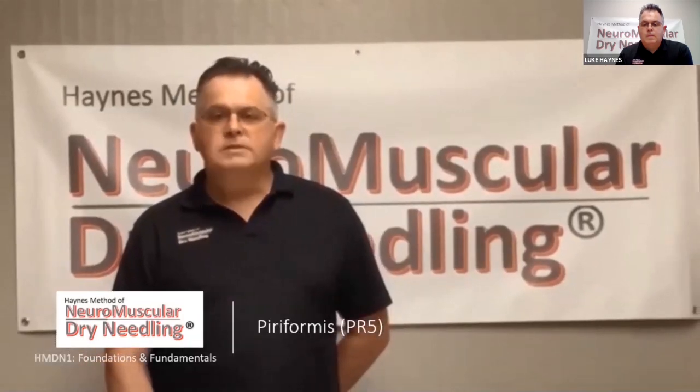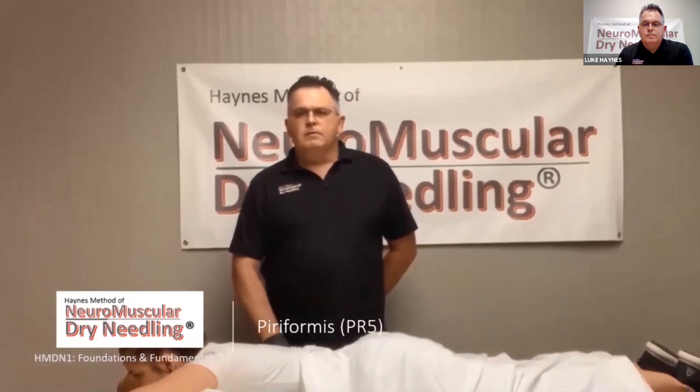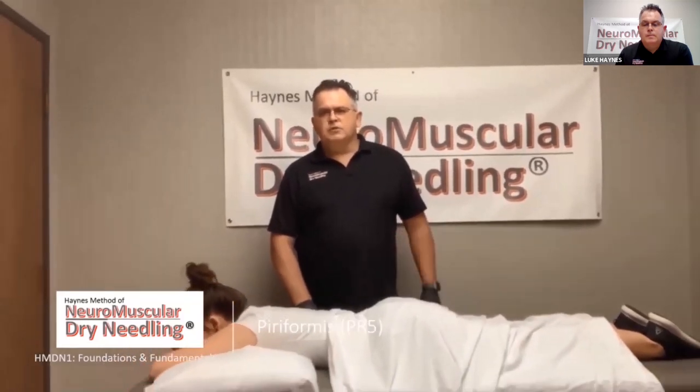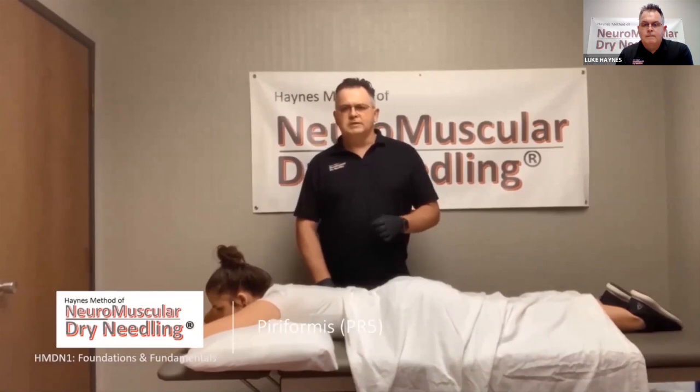For the piriformis, the patient again will be in the prone position. Needle length can be 30 to 50 millimeters. The backdrop here will be the ischiofemoral ligament. For the lateral attachment, we'll palpate for the superior aspect of the greater trochanter and locate its medial-most aspect. Needle insertion point is 2 finger breadths medial and 1 finger breadth superior, posterior to anterior using the ischiofemoral ligament as a backdrop.